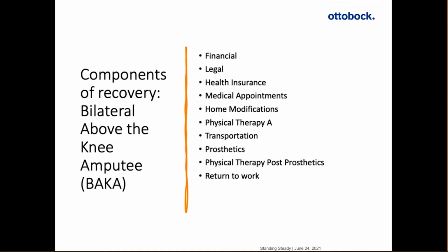My initial prosthetic fitting was in March of 2007, so just a few months after. I showed up, and the initial check socket was attached to the stubbies. The practitioner and his team, the intentions, I think, were to keep me on these stubbies for maybe a few days, a couple weeks, but I, at that time, was a bit stubborn. I wasn't having it. I was ready to get up and get walking. My daughter had been kind of bragging it up that she was taller than me, and the gauntlet was thrown, so I was going to be pretty aggressive.